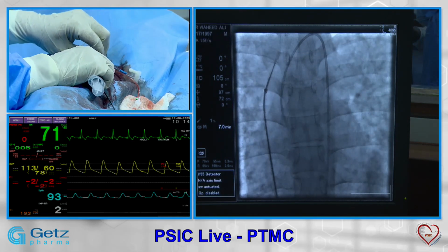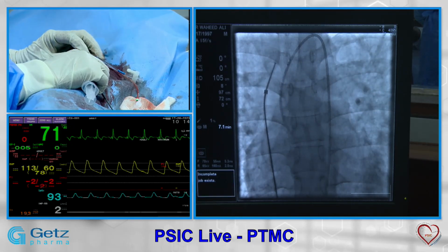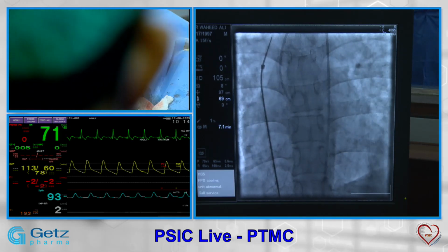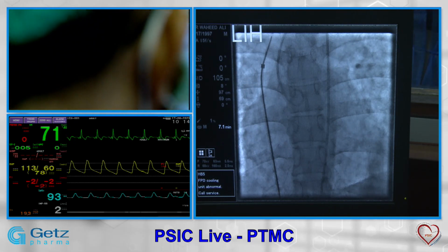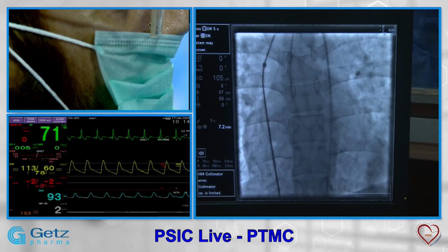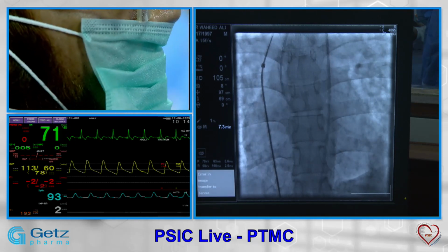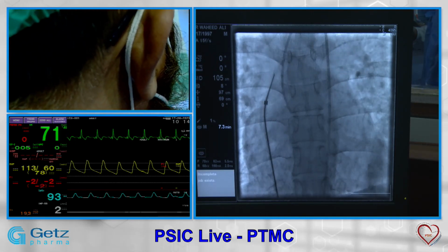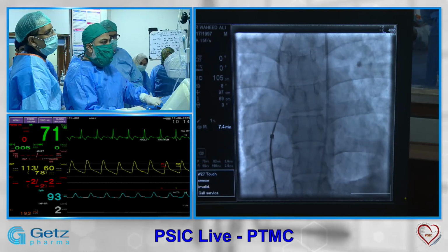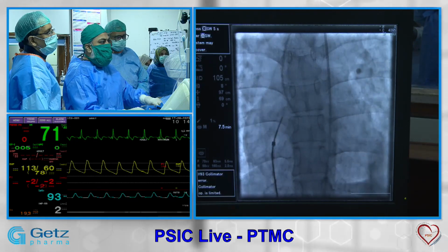So we'll go down. Now the important thing is, can you please center the heart? A little lower. Yes. Now the important thing is, what are your aims of puncturing? This one is dropping into the aorta, so I need to rotate. If your aim is to puncture higher, usually we stop near the level of the aorta, here.